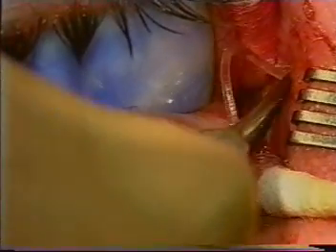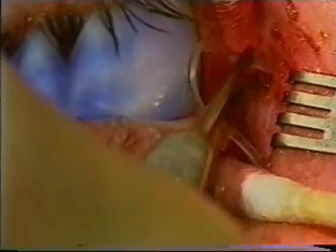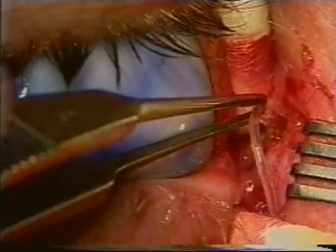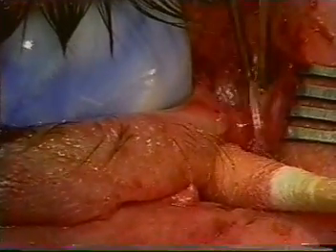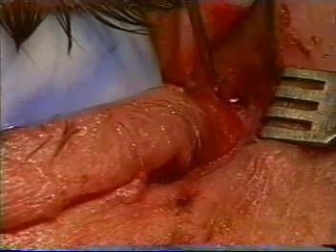The cut end of the silicone tube is then inserted into the distal end of the cut canaliculus. Sometimes some resistance is encountered, and it is necessary to try several times before it feeds into the lacrimal system. Here we see the silicone tube sitting comfortably within the lacrimal sac.